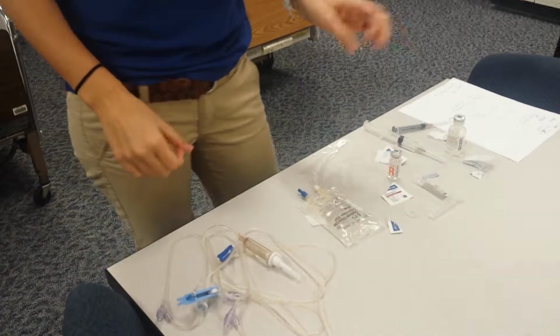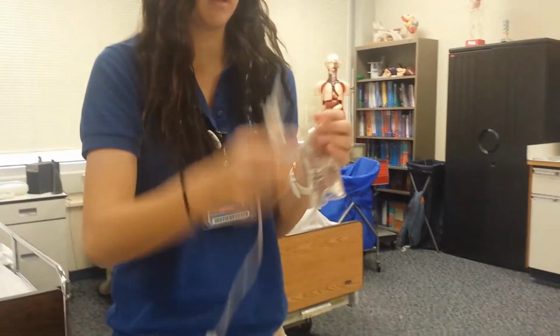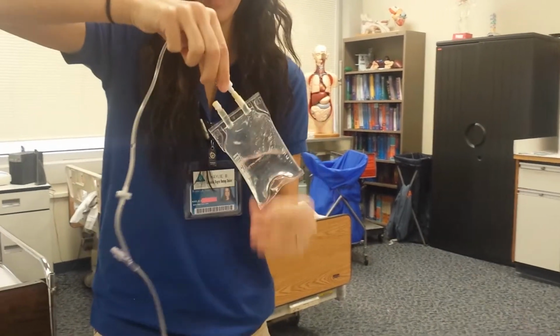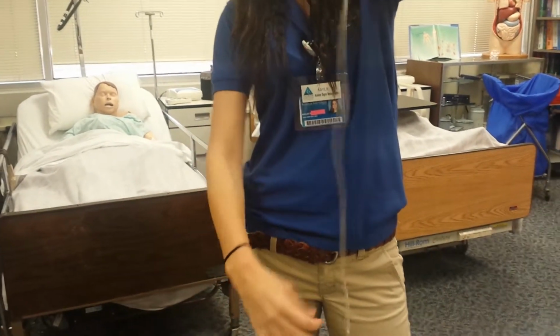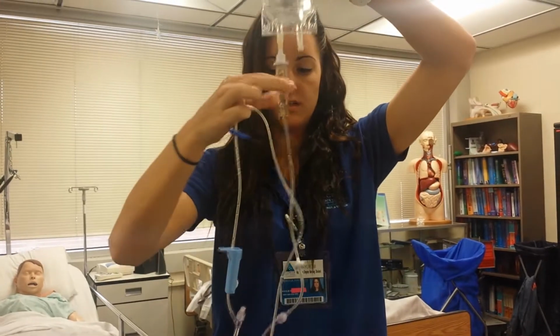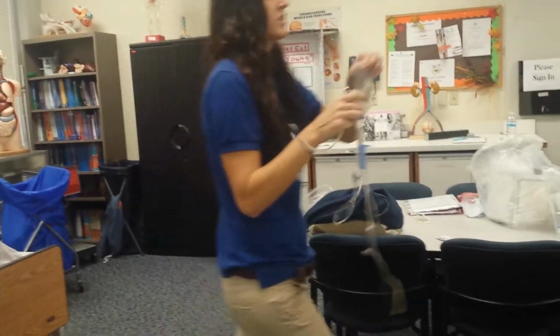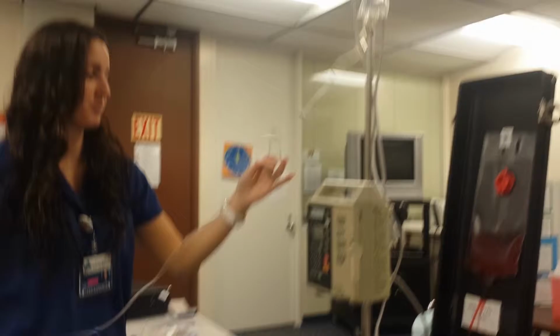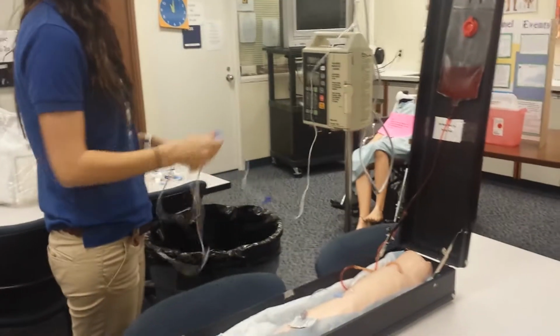Okay, at this point I'm going to spike my bag with the tubing. And this is sterile because it's still capped. Close the roller clamp and squeeze the drip chamber. Okay, now I'm going to come over to my patient's room because I am all prepared to give them this medication. I'm going to prime the line to get all the bubbles out.